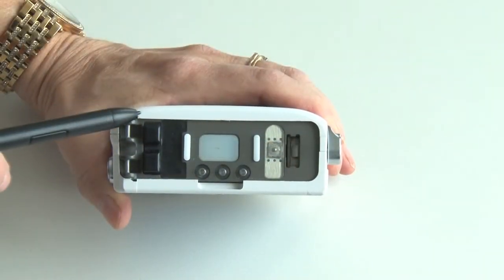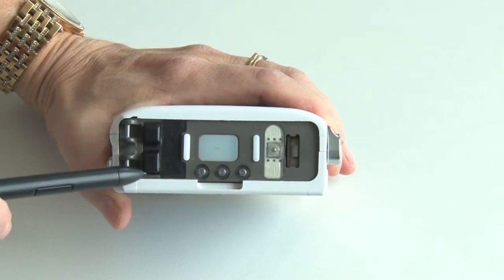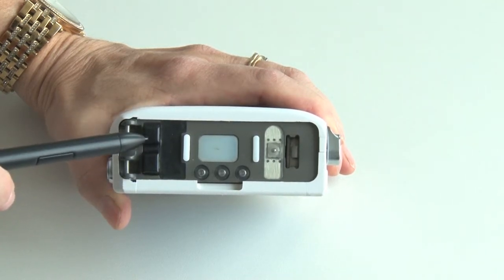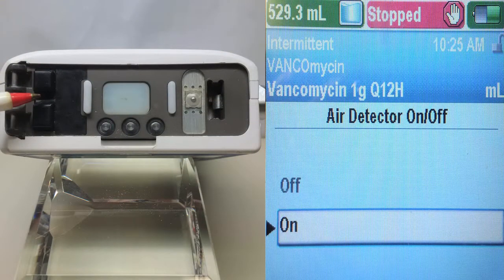The pump is built with an integrated air detector. If air is detected in the portion of tubing that passes by the air detector, an alarm will sound and the pump stops. Please note that the air detector can be turned off. However, our pharmacy sends the CAD Solus pumps out to patients with the air detector enabled as a patient safety measure.